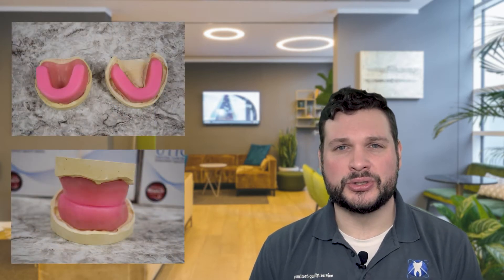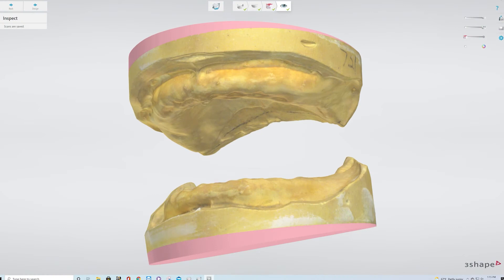Once the impression is taken, the next step is to make a model. For both traditional and digital dentures, our lab techs will pour a good old-fashioned stone model. For traditional dentures, this model is used to fit bite blocks. For the digital process, they will be scanned using our 3Shape benchtop scanner. The model of the impressions is the first set of information required in making a good prosthesis. The next step is to acquire the vertical dimension and centric relation.